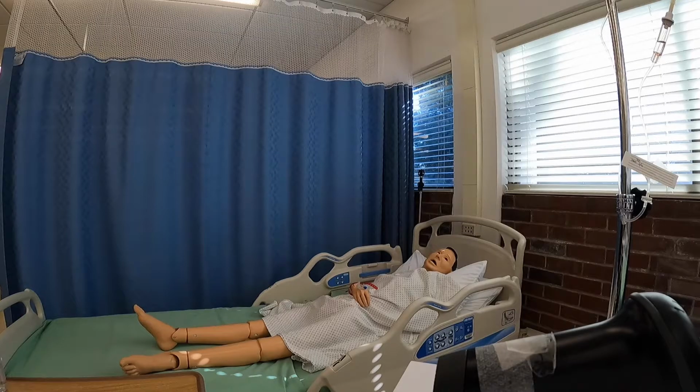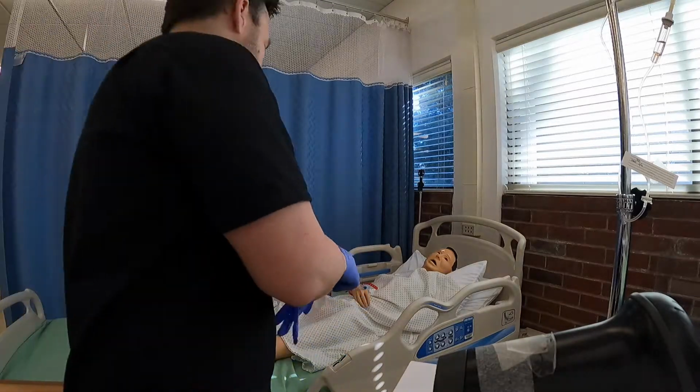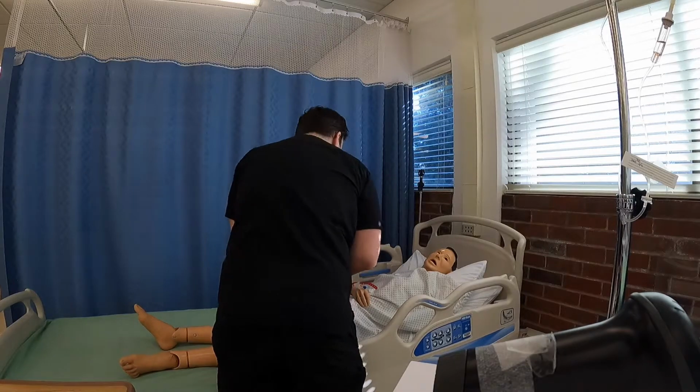So now we're in the patient's room. I've knocked and I've done my hand hygiene, and I'm going to approach my patient, who is Mr. Alan Covey. So I'm going to ask him his name and date of birth. He verifies that for me. I'm going to ask him if he has any allergies. It appears he has shellfish and iodine. So I'm going to come over here and verify that for myself. And again, I have his name, date of birth, and his allergies.